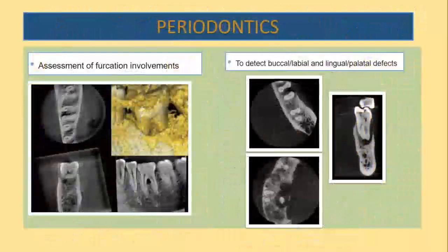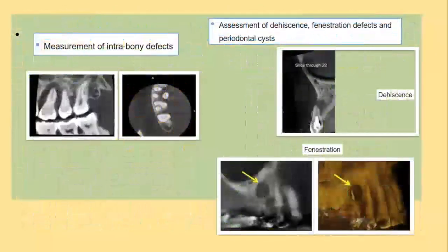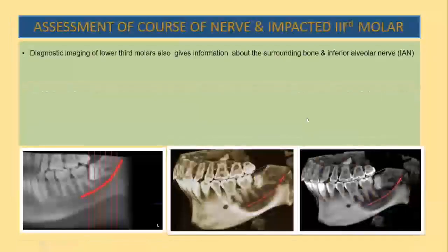Periodontics, you could see furcation involvements like never before, literally. I should just mention here, when I go to airway space analysis, I'll tell you probably. There you could see these intrabony defects that are there around the tooth causing perforation of the plates. You see that plate perforated here, right?